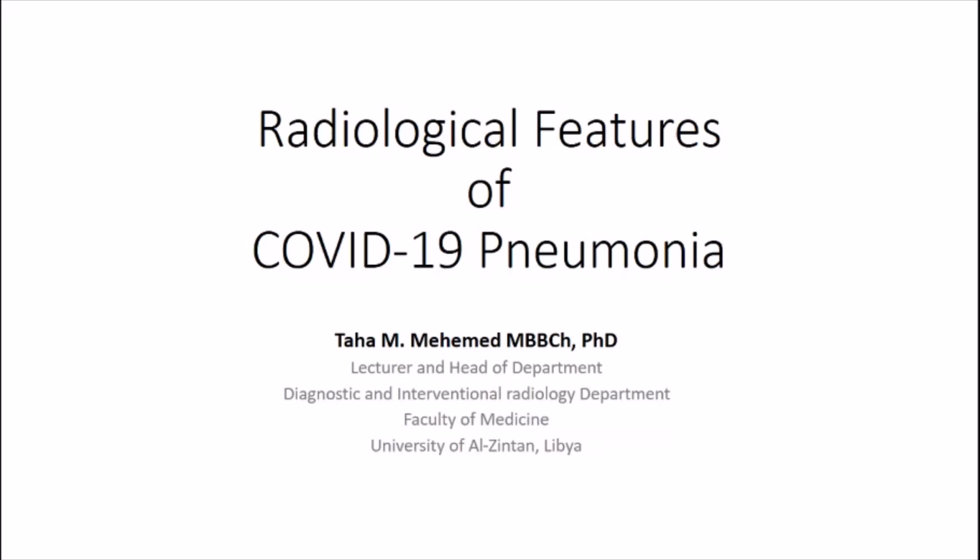So I am Dr. Taha Mehemed. I am the lecturer and head of department at the Diagnostic and Interventional Radiology department in the Faculty of Medicine, University of Zintan, Libya. Today I'm going to talk about the radiological features of COVID-19 pneumonia.